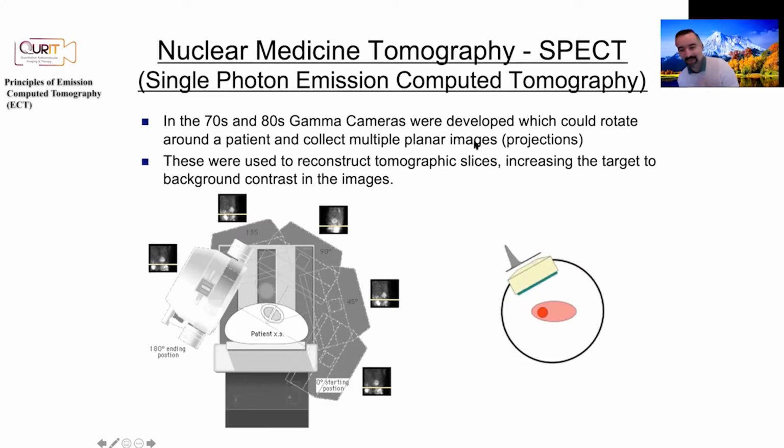Believe it or not, I know of people who have tried it another way, instead of rotating, because they didn't have the mechanical utilities. Let's say you have a really old planar imaging device, and the subject is sitting here. They didn't have the mechanics to rotate around the subject in really old scanners.